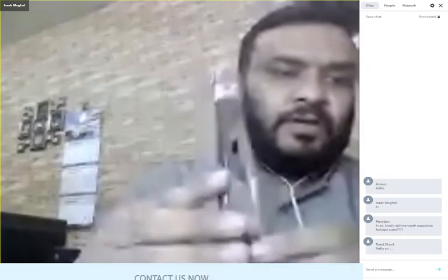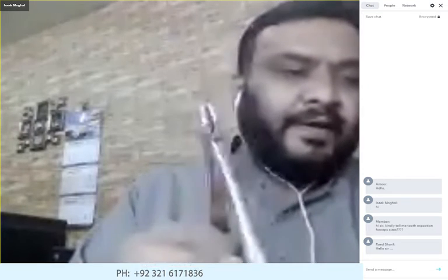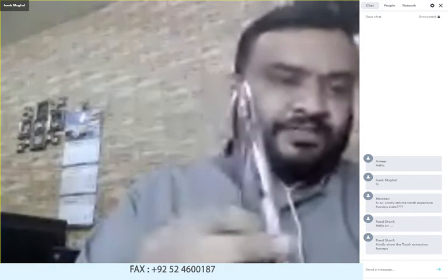This is a forceps, and it is for upper anterior extraction forceps.